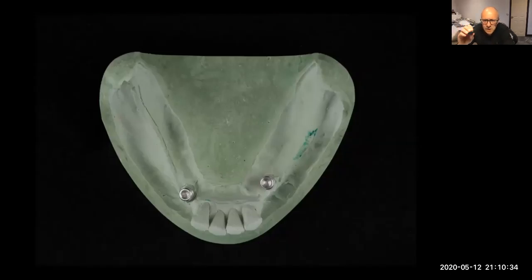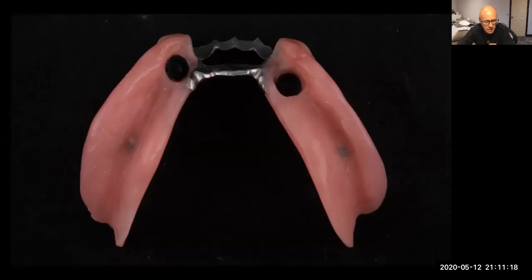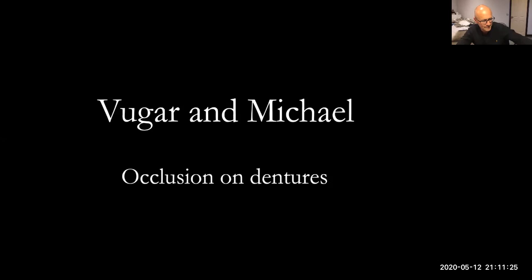Again, like lowers, Miriam said, what's the best position for implants for a partial denture situation? Well, in an ideal world, the best is at the back there. So it's like a table. You'd have one there, you have support at the front, and then at the back there. So it's a bit like a table or a tripod. But the bone, in terms of the ID canal, etc., it's tiger country putting implants in there. These are often the only places that we can really get them in comfortably without grafting. And so it's just using the same principles: really good rigid chassis, open framework, fully extended, right up the retromolar pad. So that's the important thing.